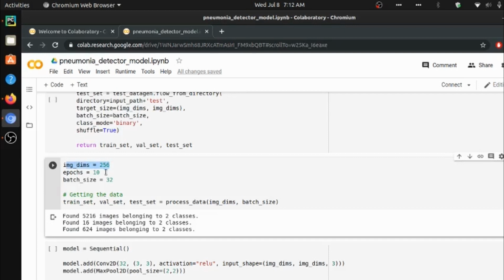In the previous iterations we have also tried various sizes like 512 cross 512 and 128 cross 128, but we were getting varied results in both of them, and ultimately we have stuck to 256 cross 256 because we are getting the best result in this particular size.